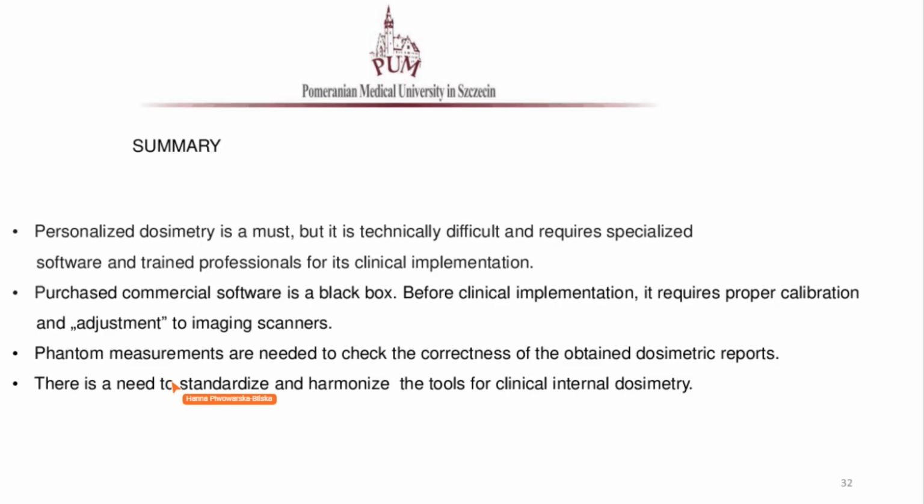To sum up my lecture, I would like to say, firstly, personalized dosimetry is a must, but it is technically difficult and requires specialized software and well-trained professionals for the clinical implementation. Secondly, commercial software purchase sometimes can turn into a black box.